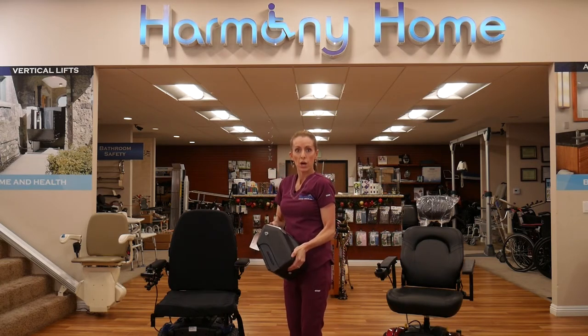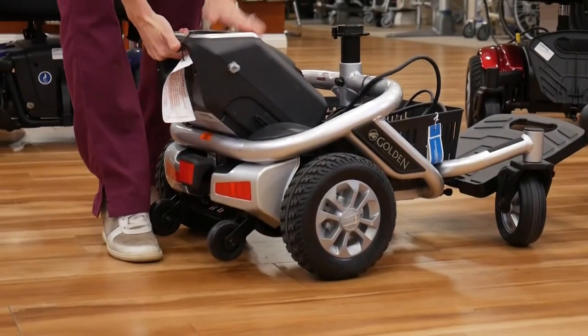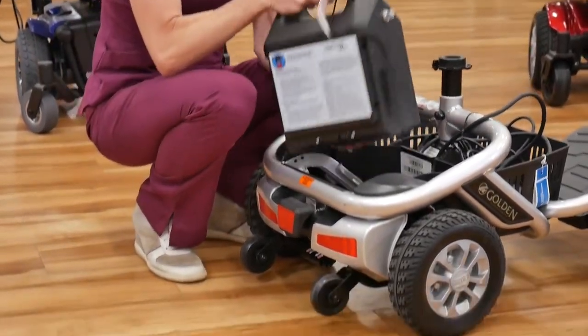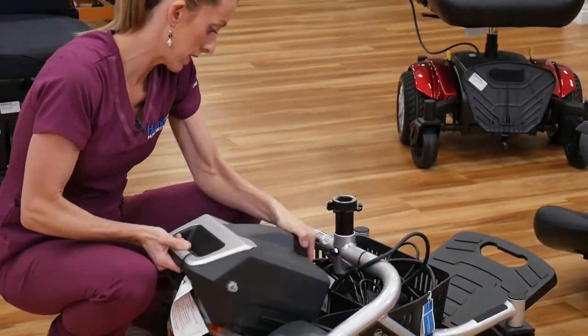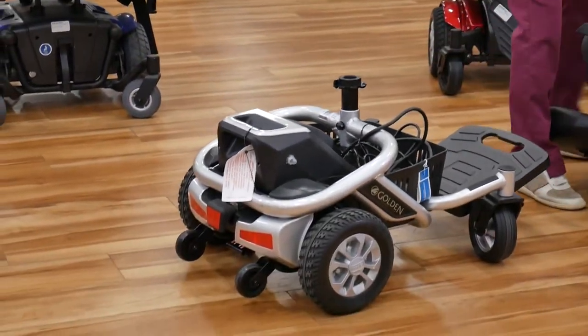Then we have our battery box, and we put that back in place with the color side up. If you have a device that doesn't have a color indicator, it's usually with the writing down. That just slides in.